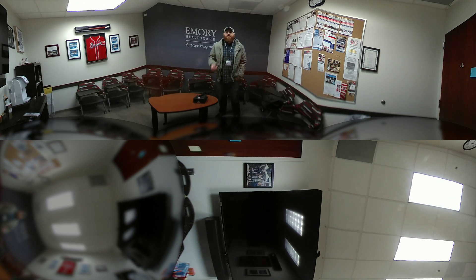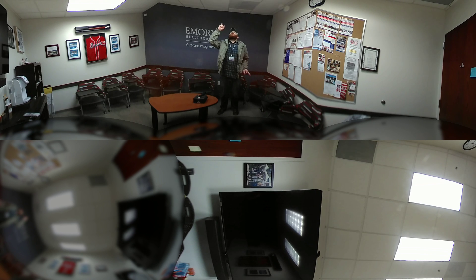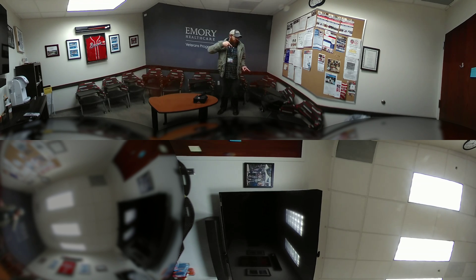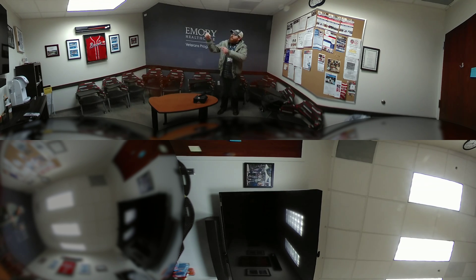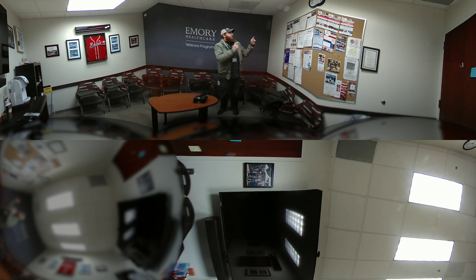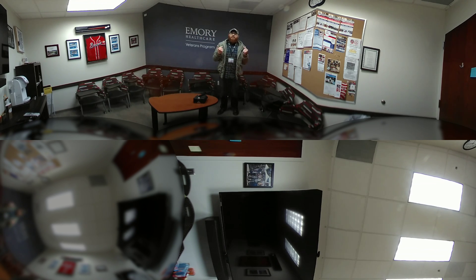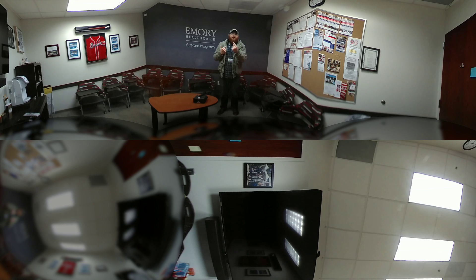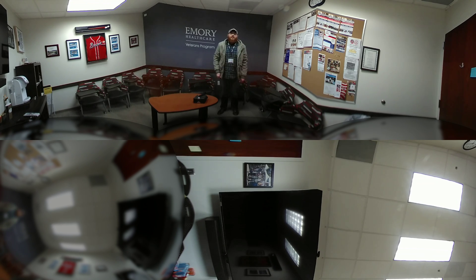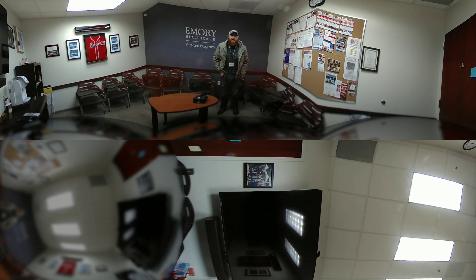Let's get you familiar with your headset. Let's look up to the ceiling. Now look down here. Look to your left to see the Braves jersey. Now look to your right to see the cork board. Now look at me and do a slow 360. You'll see there's only two people in the room, you and me.